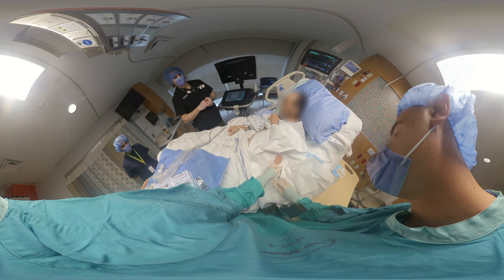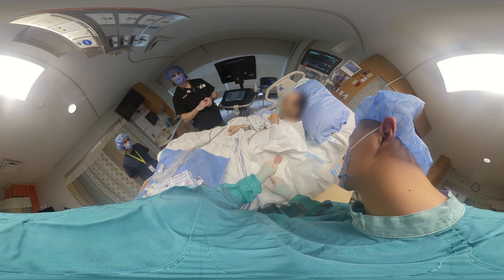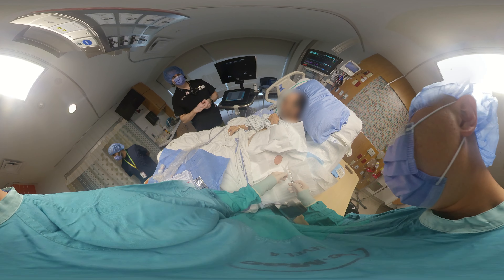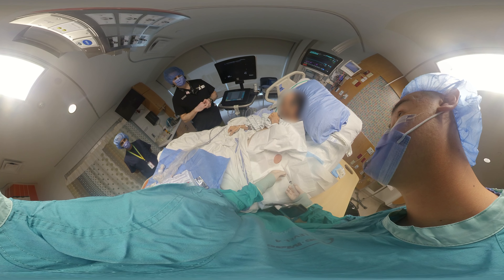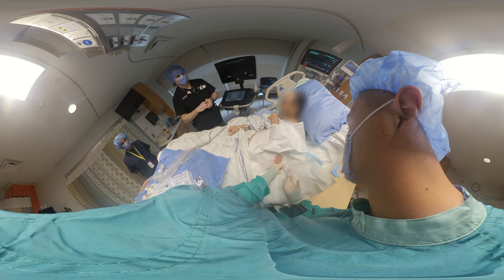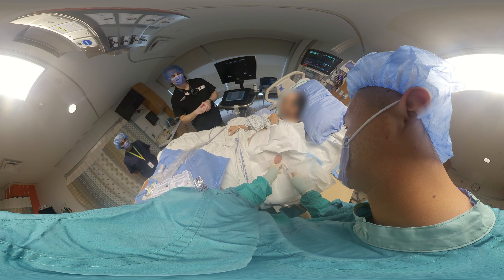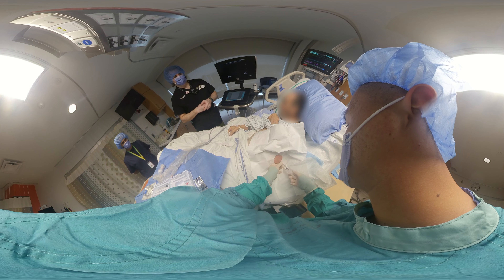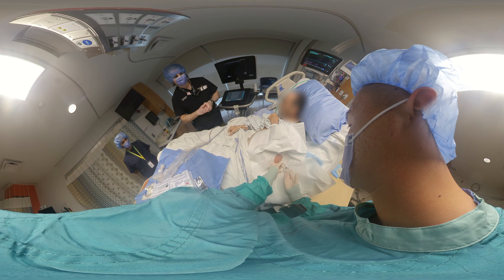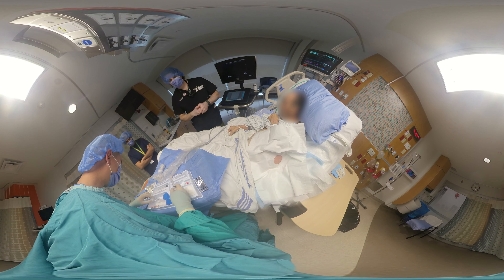Now we can get on with the procedure. We'll start by freezing the abdominal wall — freeze the skin first, then go down to the peritoneum. We'll go down to the peritoneum and make sure we have a safe track in order to aspirate peritoneal fluid. Aspirating and injecting as you go is a great technique to make sure you're not in a blood vessel.